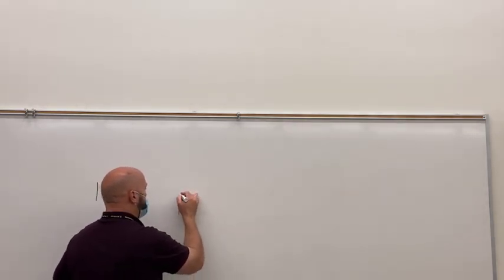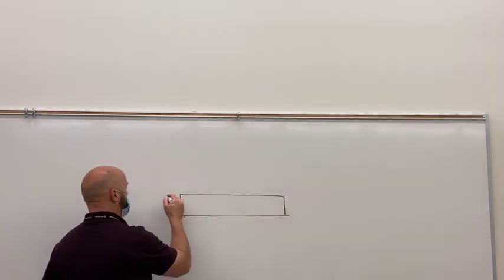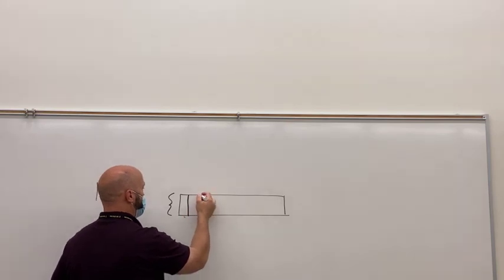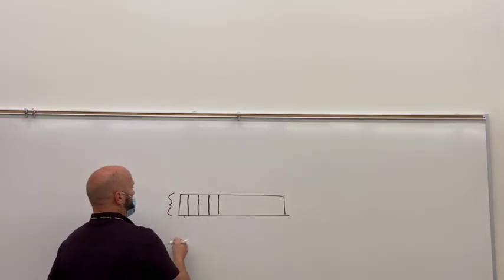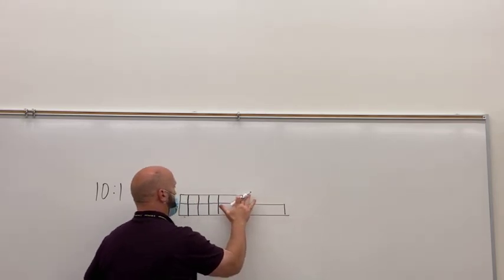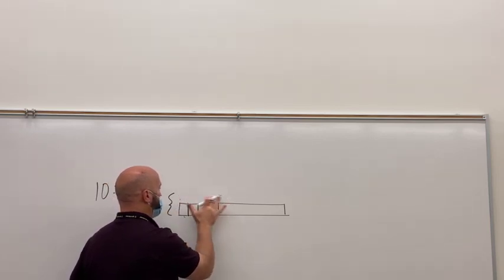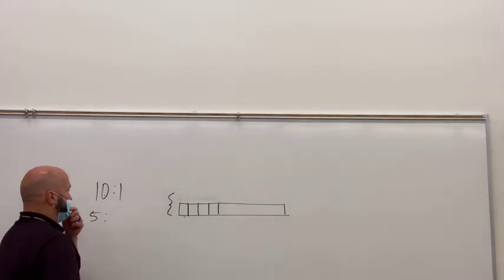So what they did is, let's say we had a 10 to 1 grid that was this thick, and the interspace material was that far, or the grid strips were that far apart. They took our grid and cut it in half, like so. Now what's that going to do to grid ratio? The height came down, so if they cut it in half, what's that number suddenly? 5, right? So it's 5 to 1.